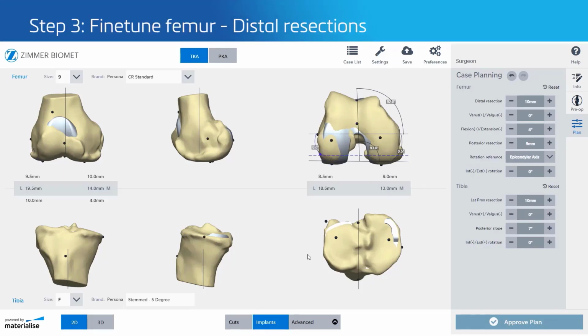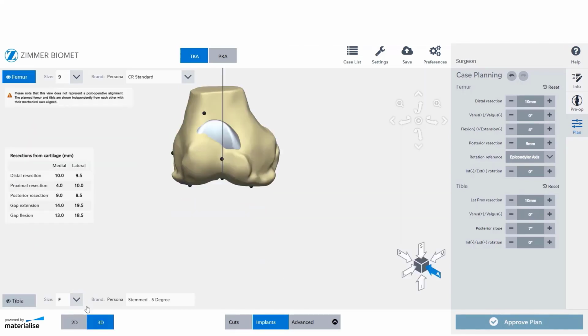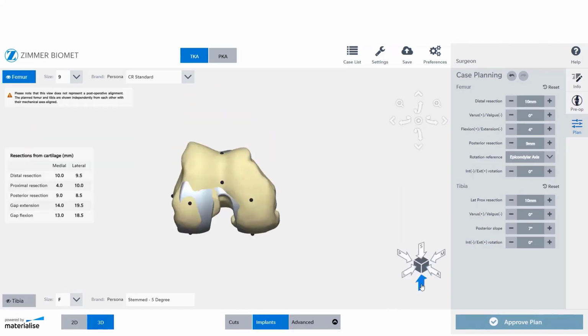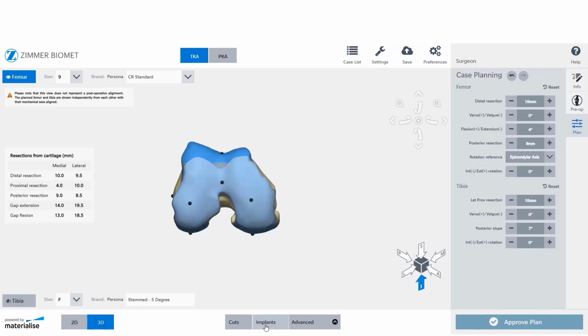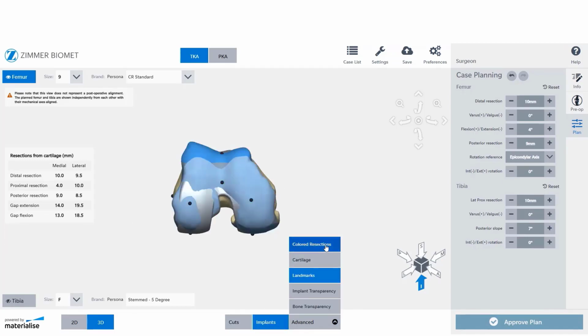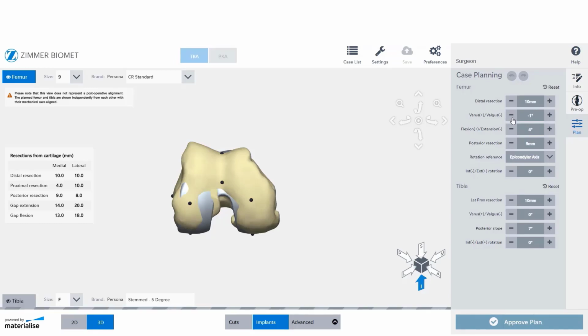Now refine distal resections. Go to the 3D view and deactivate the tibia. First, do a visual check of the cartilage wear patterns and assess how you want to compensate for cartilage wear. You can adapt the distal resection level in function of the patient's anatomy and your alignment philosophy. If you want to follow a resurfacing philosophy, you can change the varus-valgus angle of the femur, which will impact the distal resection level.